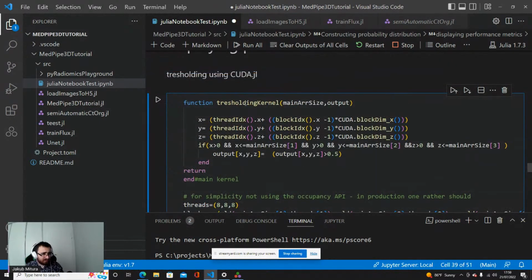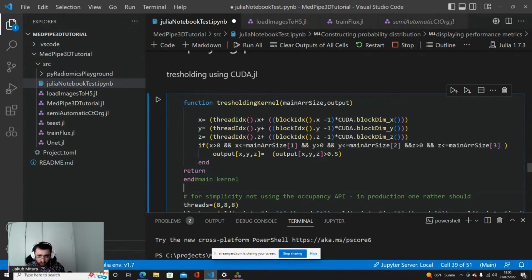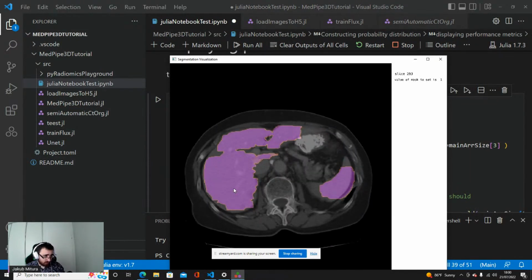However, in order to get a metric, we need to have data prepared. There are a lot of different metrics, but most of them are based on the fact that the algorithm should be sure about the result. We are checking each voxel, one by one, and each voxel should be either liver or not liver, some label or other label. But now we have a different situation. Now we have floating point numbers. Our algorithm decides that in some places there is high probability, in some places low probability. So we need to binarize it.